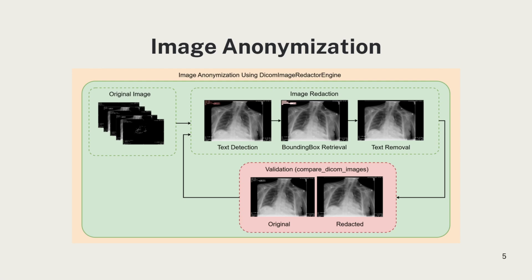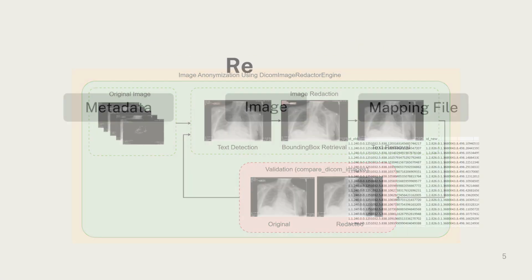And then we apply methods of pixelization, blackout bars, and text overlays to obscure PII, such that the underlying medical images remain clear for diagnostic purposes. We conclude by manually reviewing a sample of the images to ensure that all PII has been removed and the image diagnostic quality is still maintained.